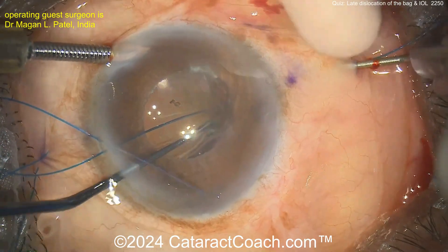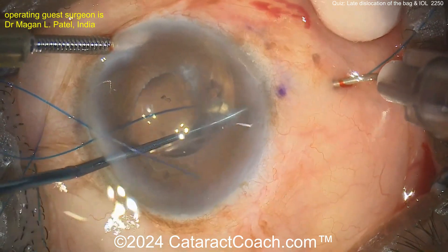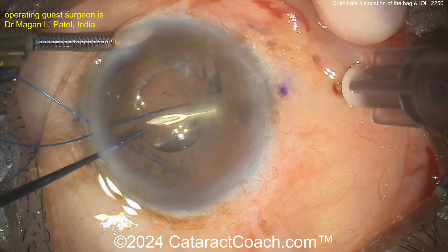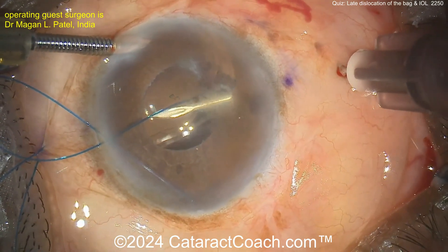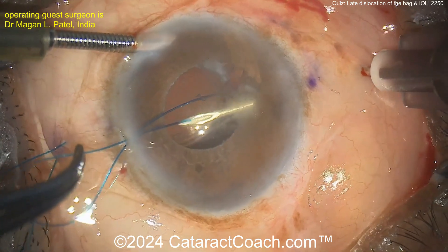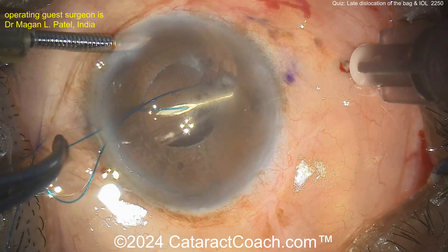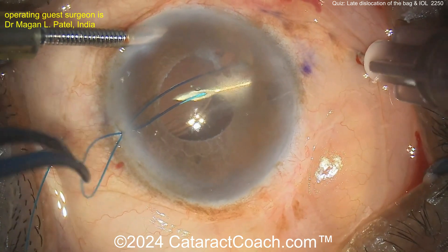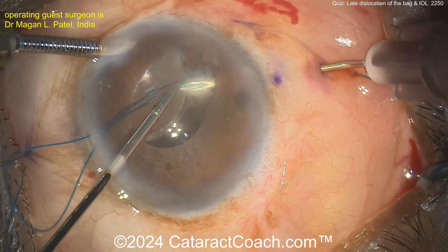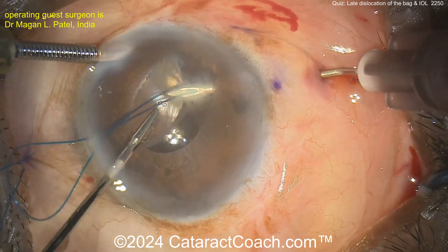Passing this suture in, and then you'll see some cautery. Get that haptic now behind — this should be sufficiently supported for the entirety of the patient's life. Pulling this through — I still don't quite understand why two pairs of side ports were made on each side. I think you could have done okay with just one, but maybe it's to manipulate — okay, I'm starting to get it.